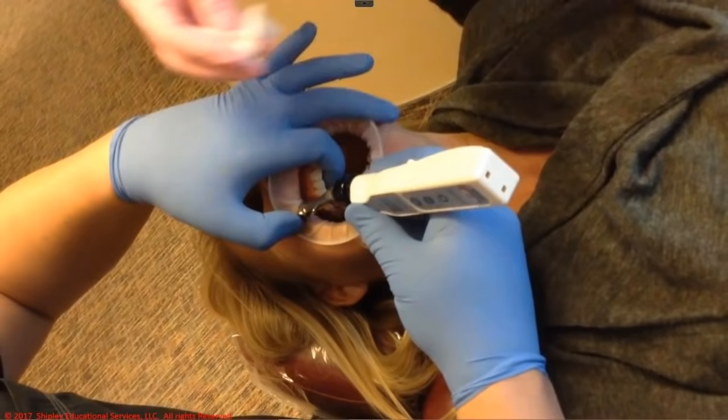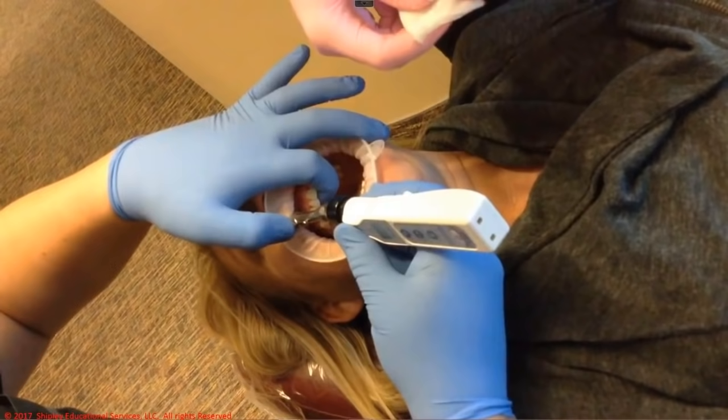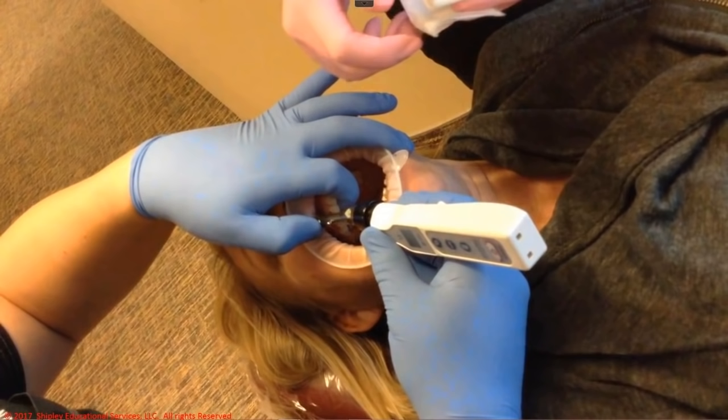Watch the patient. She's hitting the reverse for me. She's got gauze in her hand so that she can wipe the area as we're moving along. She doesn't have to wipe it very often. Maybe every 4 or 5 teeth she has to take the gauze and just dry wipe it out.